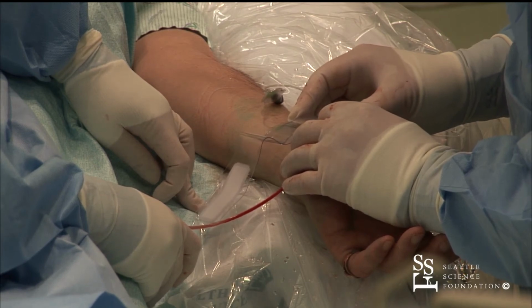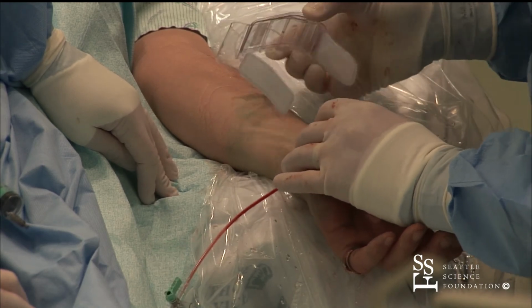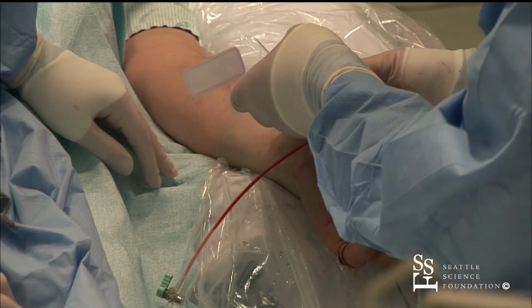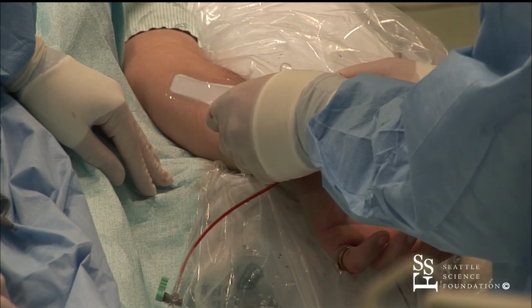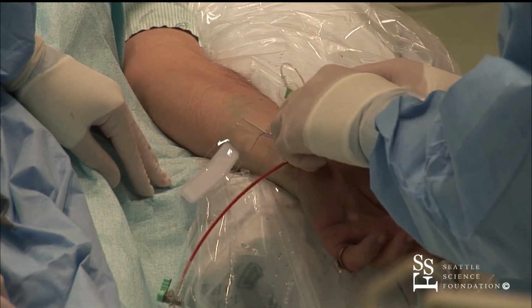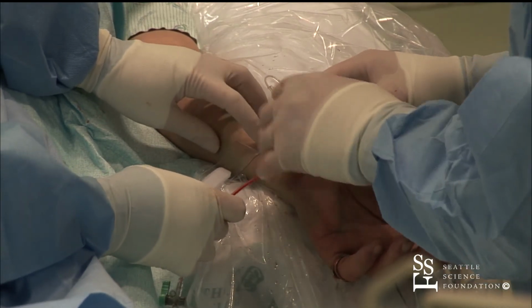With this left technique, that sheath is there. You don't worry about that. So what we're going to do is pull the sheath back a couple centimeters here, and then there's a dot on the TR band. I don't know if you can see that, but it's a green dot here. That's supposed to be about 2 millimeters in front of where the arteriotomy site is, and the reason is that you come in at an angle, where the arterial puncture site is probably 1 or 2 millimeters proximal to where the skin entry is, and so that's why you want to set up that way. And you want the hub out of the way of the TR band, really.